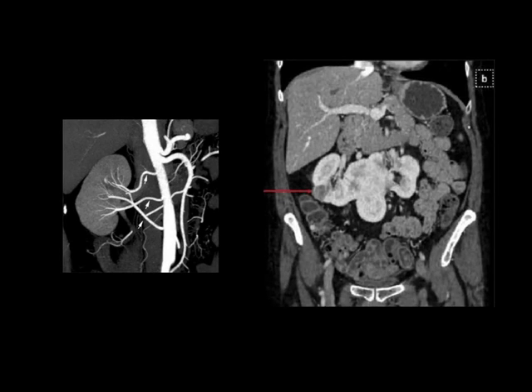So examples like this, how do you account for multiple vessels like this feeding one kidney? How do you account for a horseshoe kidney and describing the position of that lesion in that kidney? The reality is text and manual descriptions are kind of useful only to an extent. So then we decided to look at whether we can provide a representation that a surgeon can look at and easily get a mental model of before the operation.